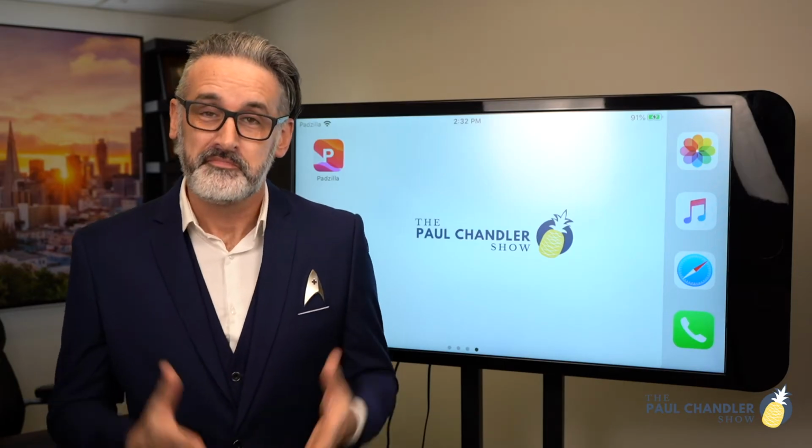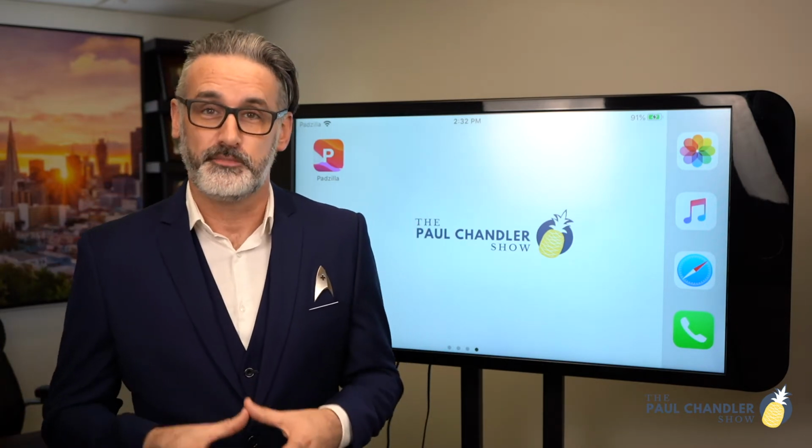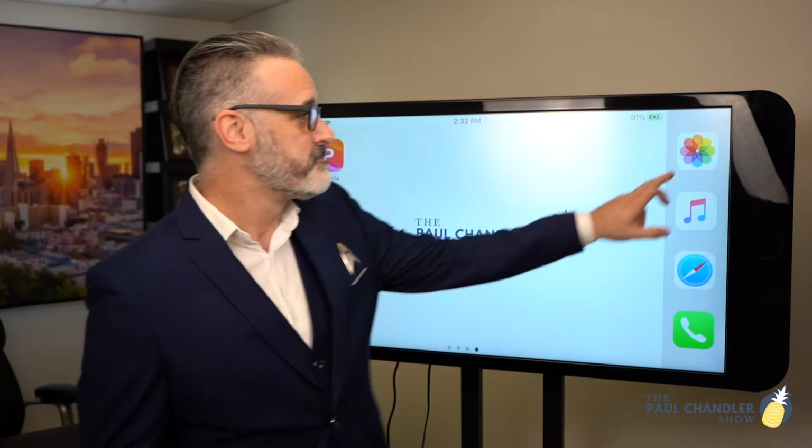Welcome back, everyone. So tonight we're going to be using the lovely Padzilla again, and we're going to be looking at a coronary angioplasty procedure being performed, and while it's going on, I'll be explaining what the doctor's doing.